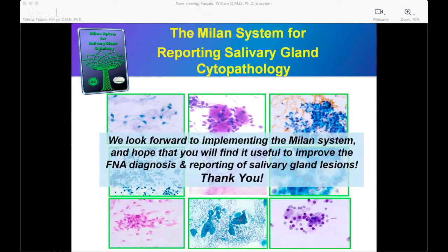Unfortunately, I will say, there are no immunohistochemical markers that help, and depending upon the context and the rest of the sample, it may not be possible to put a definitive label on it. And I would definitely say that the patient's going to have to be followed very carefully, clinically and radiologically, to exclude the possibility that instead of squamous metaplasia, you're dealing with epidermoid cells of mucoepidermoid carcinoma. And that's one of the other things I would look for, make sure there's no mucin in the background.